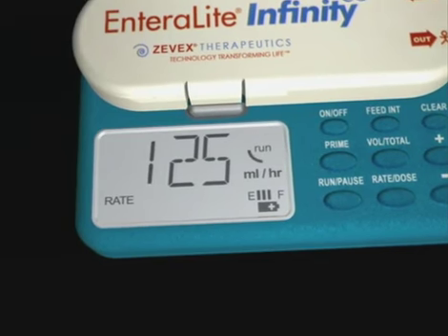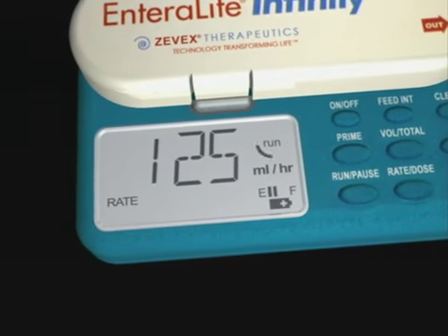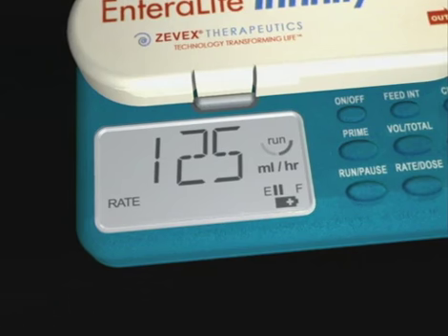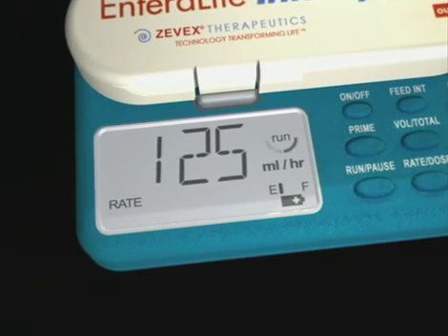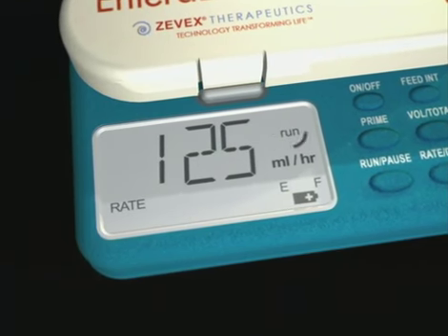When running the pump on battery power, the battery symbol will appear in the display. Each bar in the fuel gauge represents about 6 hours of charge and will begin to flash when it is half spent to let you know that about 3 hours of charge is left for that bar.